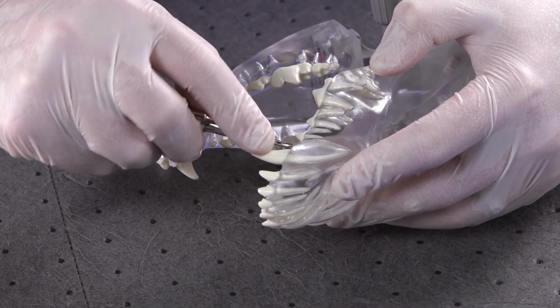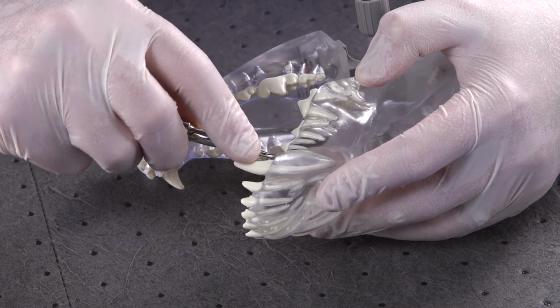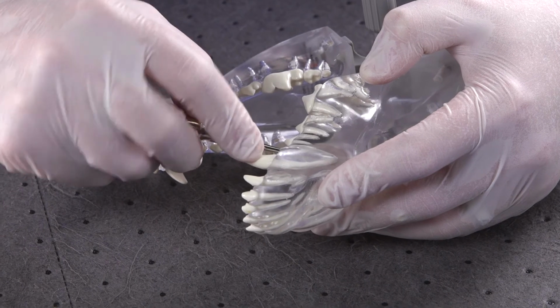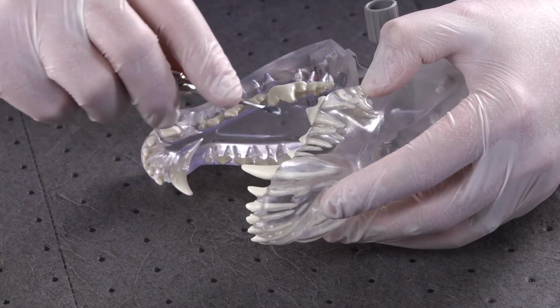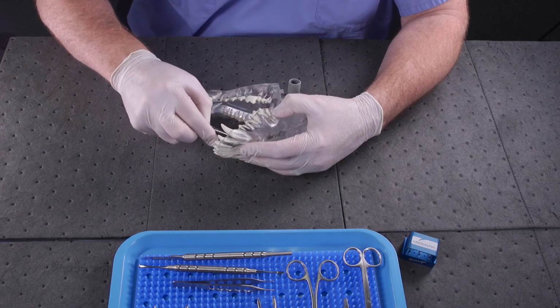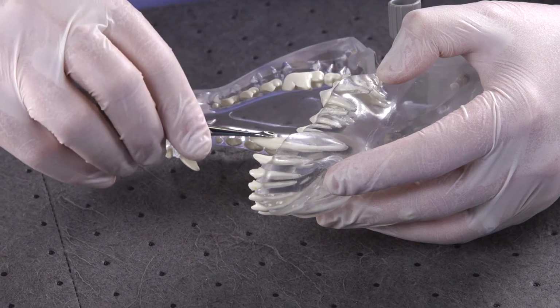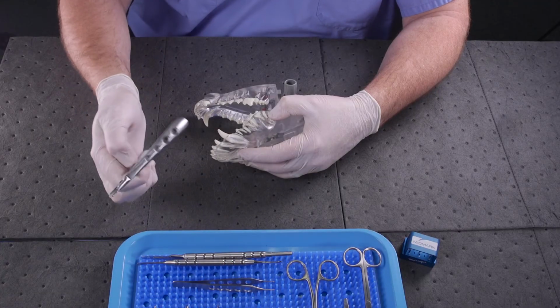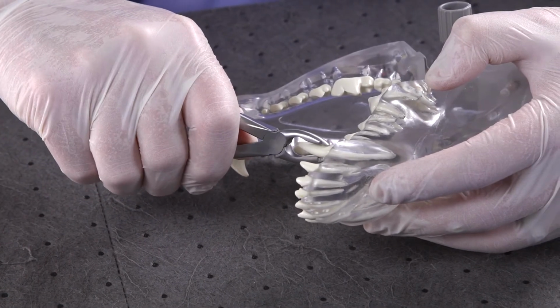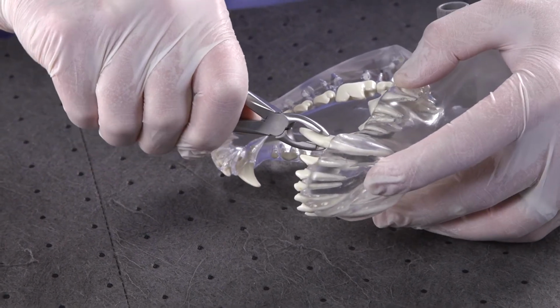And when I get between the root and the bone, I can apply twist and hold more. And then I will go even deeper in, pushing in, twist and continue to hold. And then I'll go even deeper down in, twist and hold. I'll go around the entire circumference of the tooth, including the palatal aspect of the tooth, all the way around until I can get the tooth nice and loose. And when the tooth is loose, then I can use the Extremel extraction forceps, grabbing onto this tooth with a nice firm grip, and apply twist back and forth here, and I can then remove the tooth.